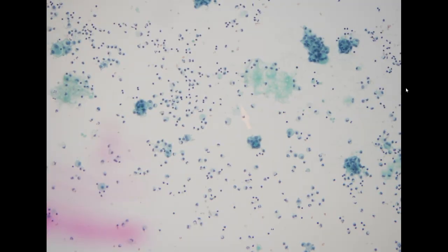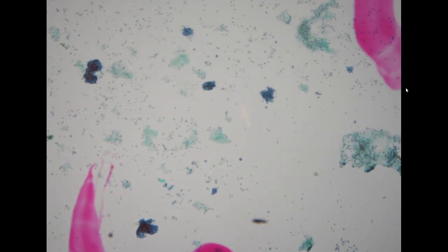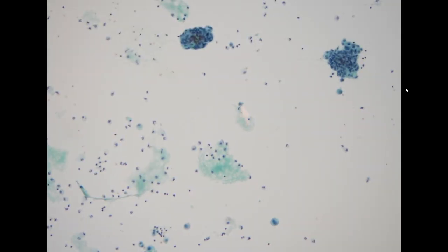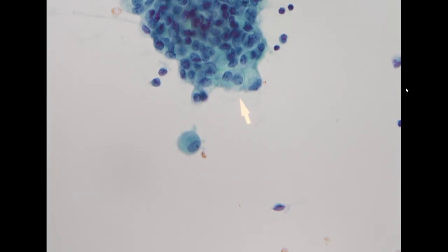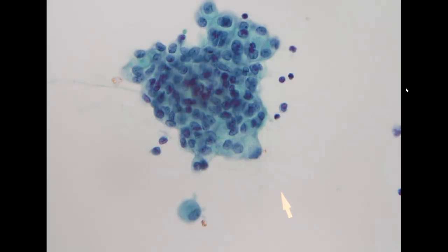HCC we rarely see in the body fluid specimen. In this specimen, we see a lot of cell clusters, mostly in three-dimensional architecture, arranged in a cell ball like pattern. When you go to the higher power, the cell has relatively abundant cytoplasm. Within the cluster, there is a little bit of polymorphism. However, you do not see a striking nuclear atypia.